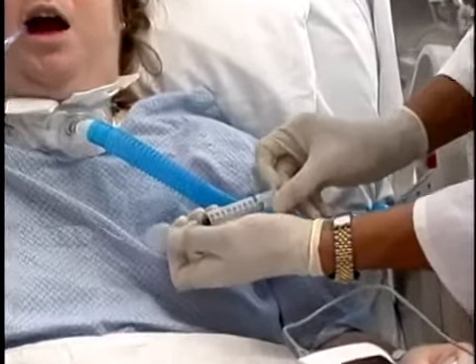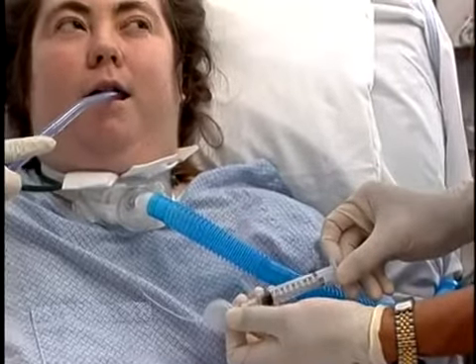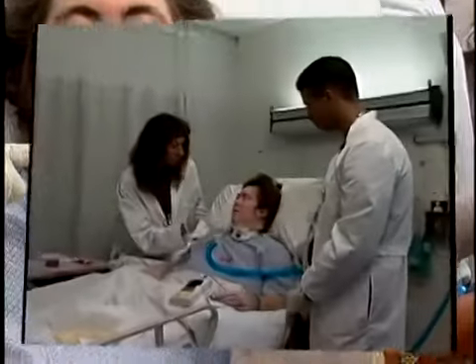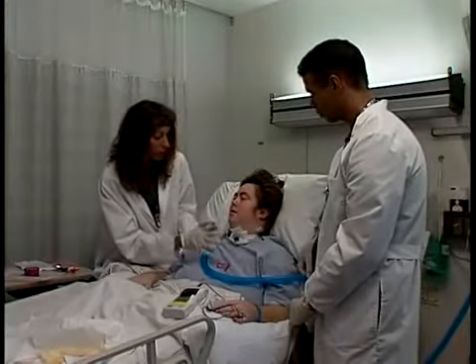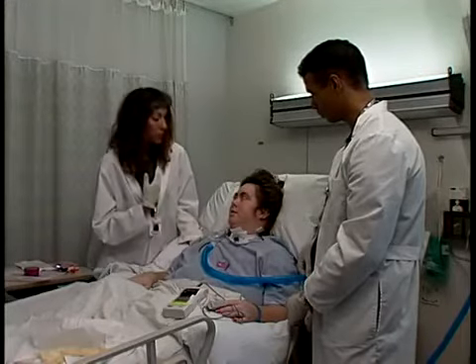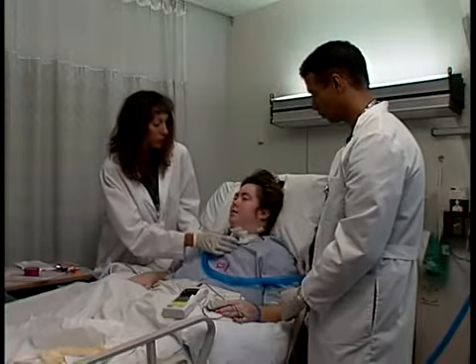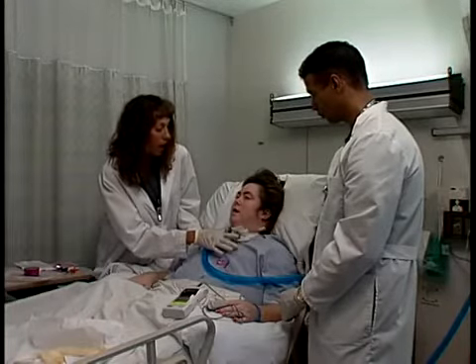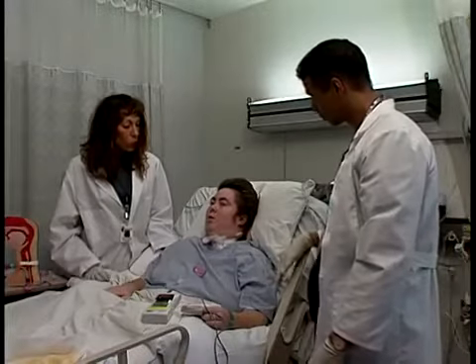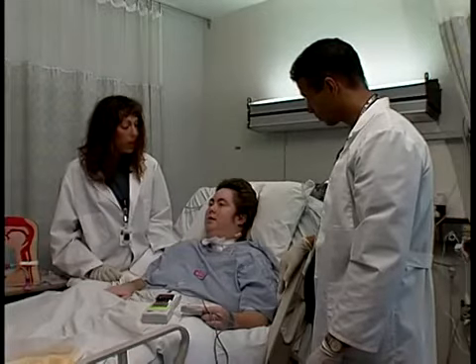If your patient has a cuffed tracheostomy tube, slowly deflate the cuff until all of the air has been removed. Instruct the patient to inhale through the tracheostomy tube. Manually finger occlude the tracheostomy tube with a gloved finger as you instruct the patient to exhale through the mouth and nose to ensure adequate exhalation. You should encourage the patient to vocalize by saying "ah" or counting to determine presence and quality of voicing.